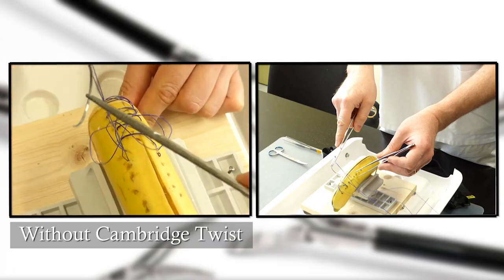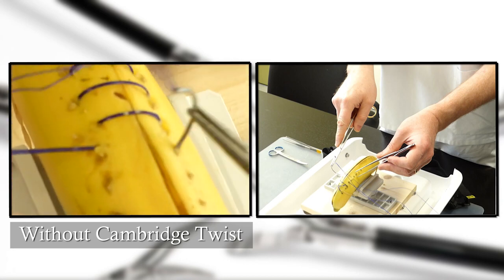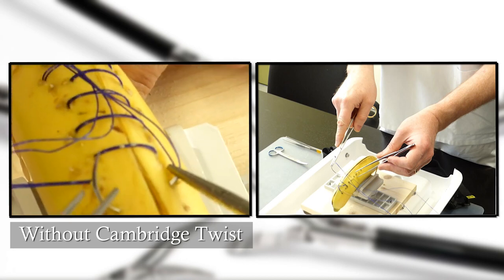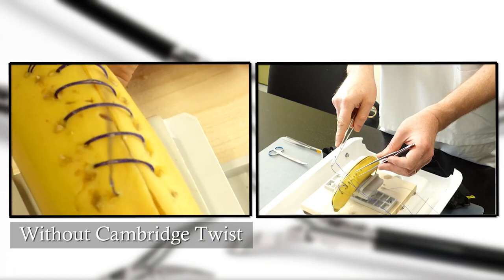Alternatively, the operator or the assistant can accompany the suture and undo the twists, but at the expense of decreased ergonomy, obstructing the operator's view or handling the suture with forceps.